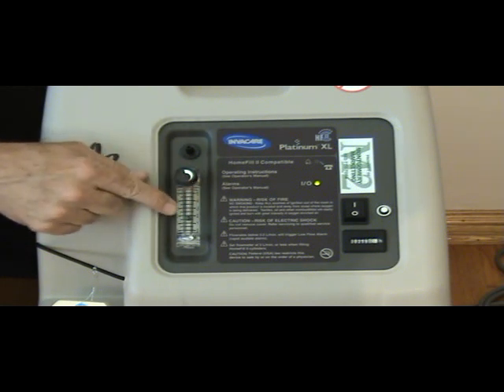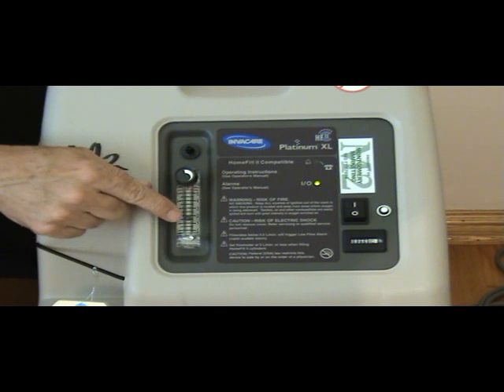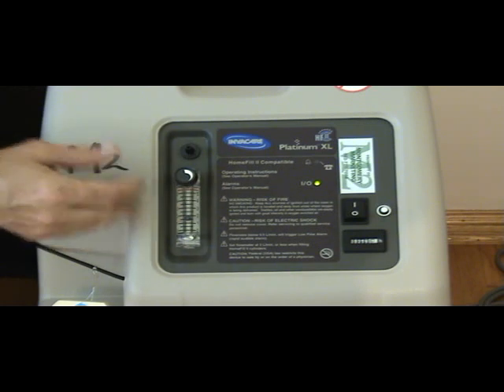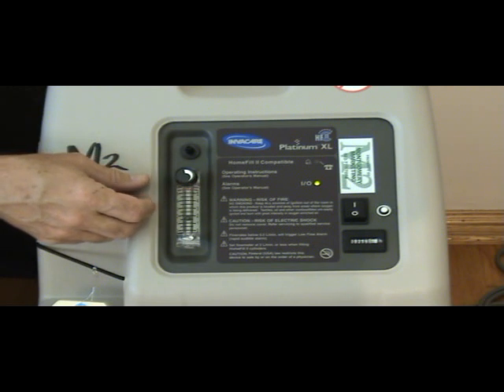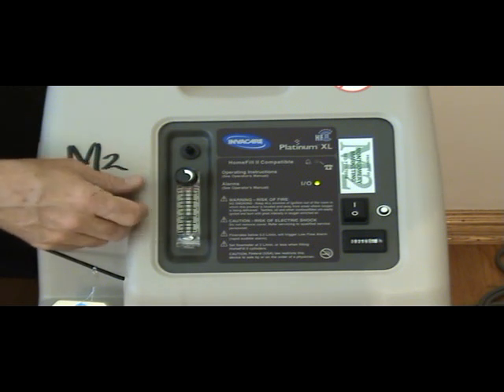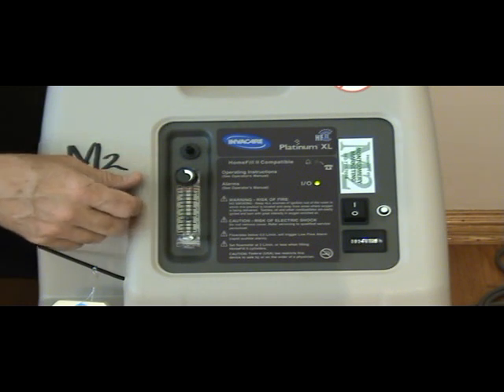This setting should not be changed unless a nurse or a doctor approves of it. Patients should not change it at their convenience or what they think is better for the patient. Oxygen is a therapy. It is provided by a doctor's prescription, and it should not be changed the same way that you wouldn't change your medication to the patient.